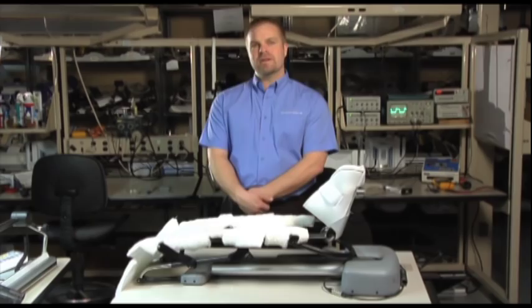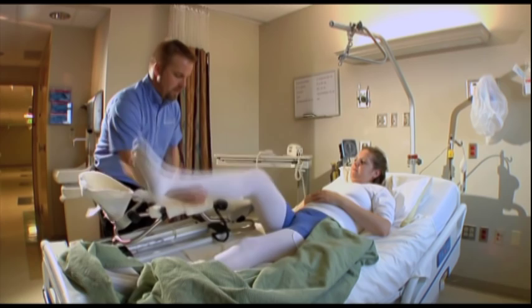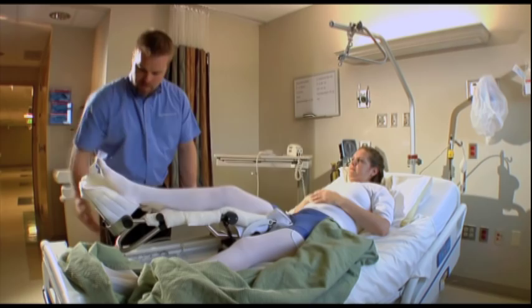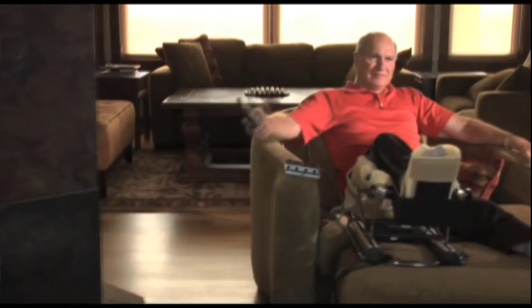It has been our experience over the past 20 years that if you ask any patient who has been properly in-serviced on the use and benefits of CPM therapy, they will tell you that the CPM machine helped reduce their pain, increase their comfort, and got them back on their feet more quickly.